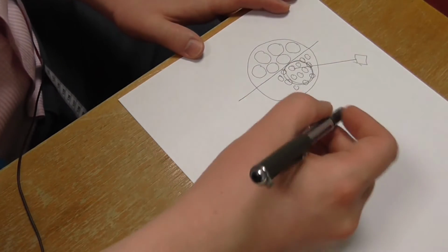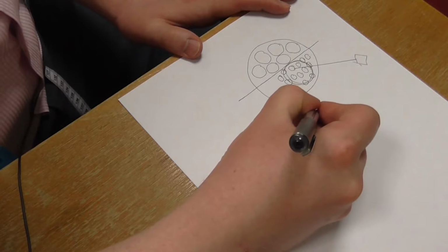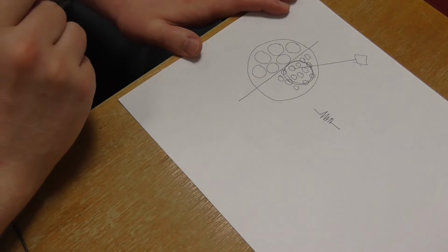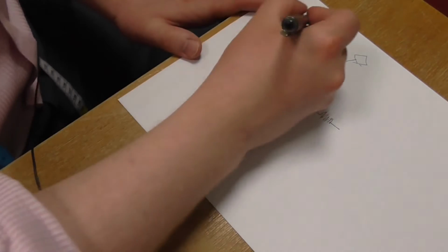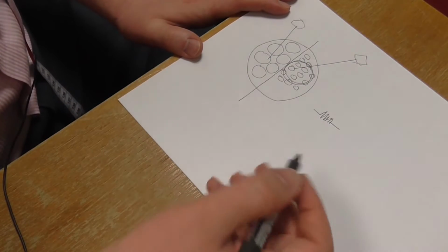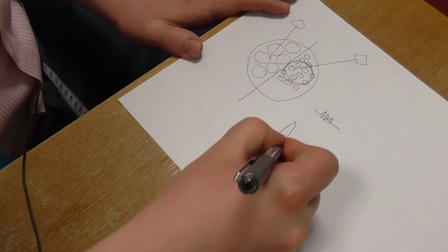Hence, what we are going to find are small polyphasic units on our oscilloscope, so they'll look like this. This is in marked contrast to the situation in the normal muscle fibres, where we're only able to pick up a couple of motor units and they're all generating reasonable amounts of electrical activity. So that's what we would normally see.